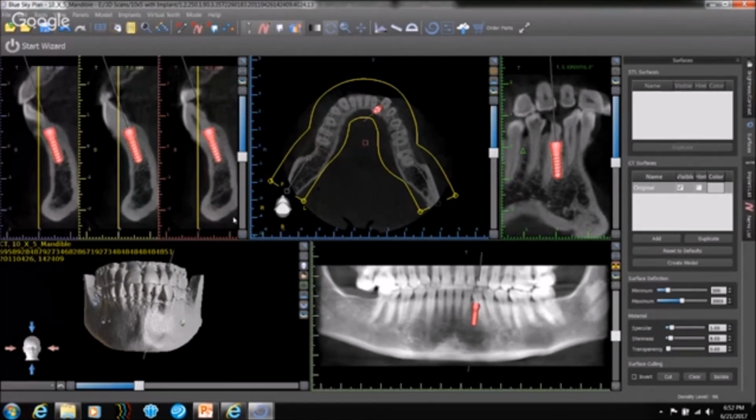The software has the capacity to take images from CBCT units as well as multi-detector CT units that you see in the hospital. So if it is a CBCT unit, those numbers are not reliable. There are some bench studies that indicate something about gray levels and things like that, but as of right now it is not mature, and I advise people to stay away from it.